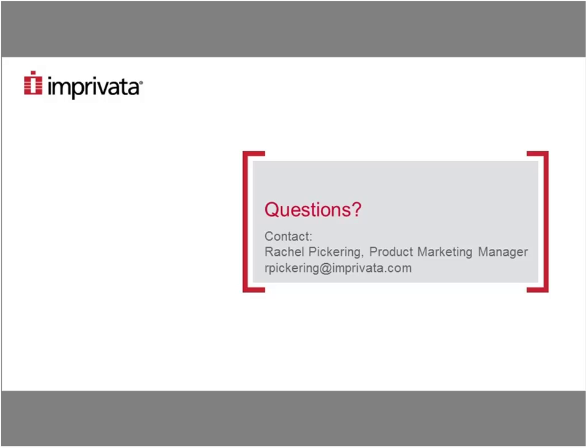Some of them, depending on the age of the device, the readers are inherent to the device, so they automatically come with the device. Sometimes it may be that you need to add on a small proximity reader, a dongle, or something like that to enable it if they are a legacy device. But we can work through that on a one-off basis depending on who you guys have in-house today.